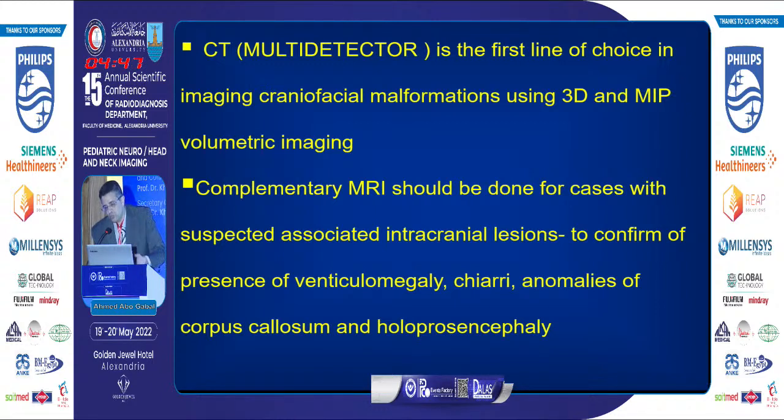Orientation of the different pathologies before interpretation helps you in writing your report and adequately detecting the lesions.